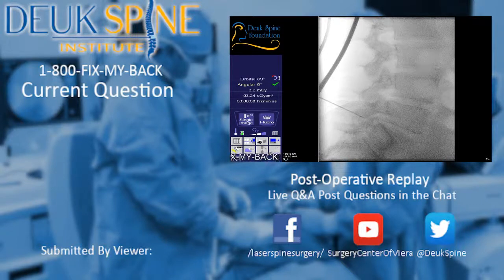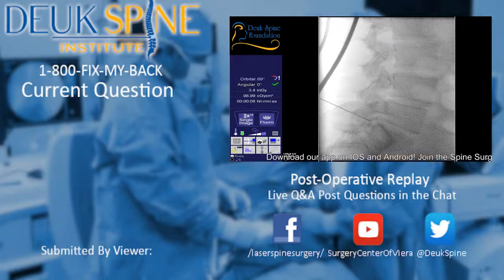I manipulated the tube. I also think I broke the scope in the process because I either dislodged or cracked one of the lenses by applying pressure, which stinks because that's a few thousand dollars to fix. But it is what it is, and it comes with the territory. So I feel like we did everything we could to fix him. Hopefully it's enough, and time will tell.